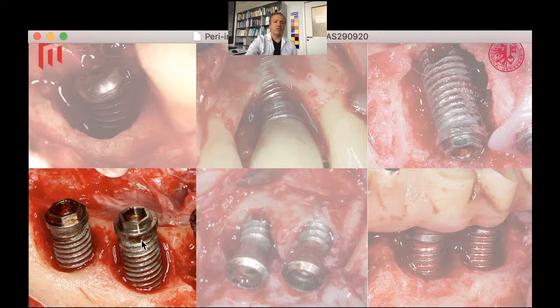We have a modern implant structure, a micro-roughened implant surface. So here we have a low potential of regeneration on the site. We have good access to the implant to decontaminate, but a surface that is difficult to decontaminate efficiently because it's roughened.